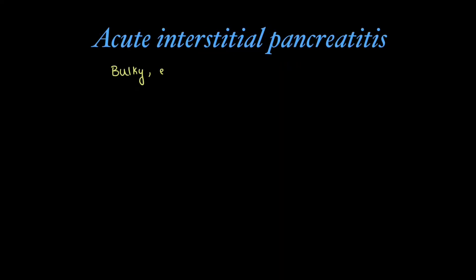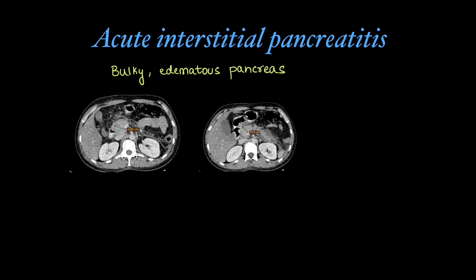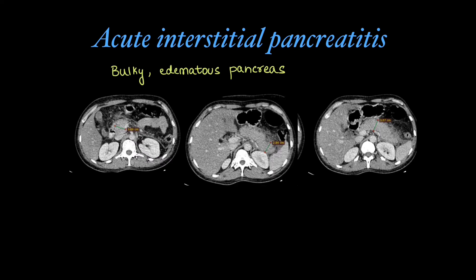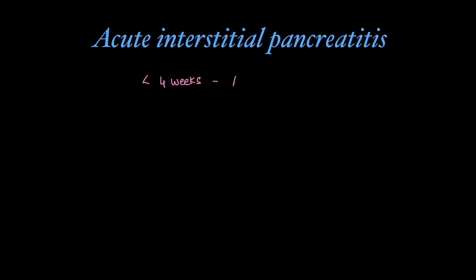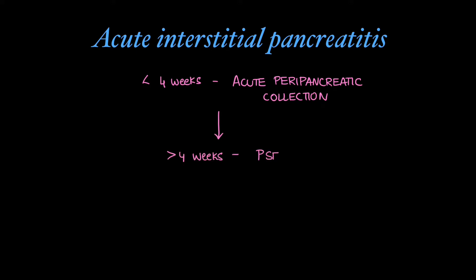Acute interstitial pancreatitis shows a bulky, edematous pancreas. In this case, the head, neck, body, and tail all show an increase in size. This condition has two subtypes based on duration: within four weeks it's called acute peripancreatic collection, and after four weeks, when wall formation occurs, it forms a pseudocyst.